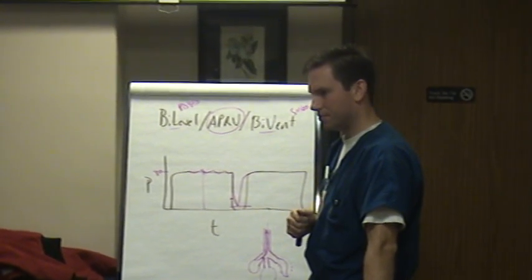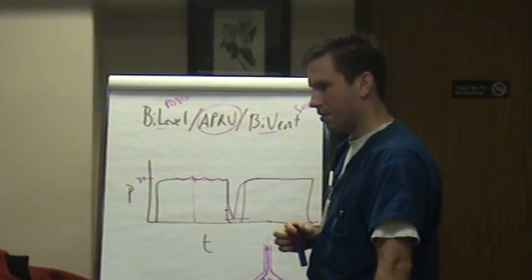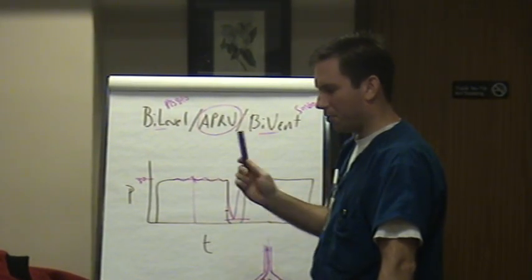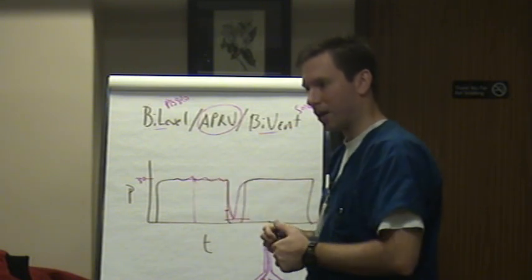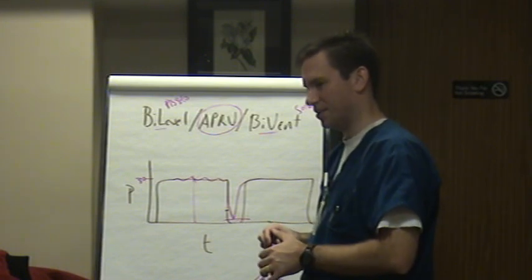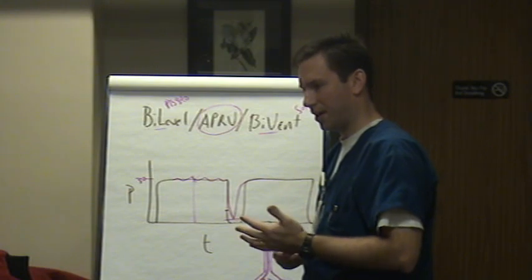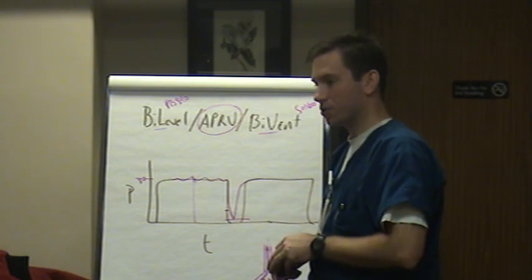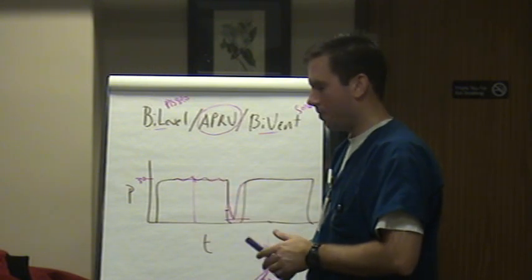Well, because they're not getting enough mean airway pressure, breathing on their own volume support. Okay, good. But why don't I put them back in PRVC and just knock them out? That way I can give them back that mean. Why can't I do that? What might happen to them? What vital sign is affected sometimes when I give them the paralytic? Blood pressure. Yeah, like if they don't tolerate that paralytic, or your CO2s are getting uncontrollably high. Those are two reasons to go right to this mode.